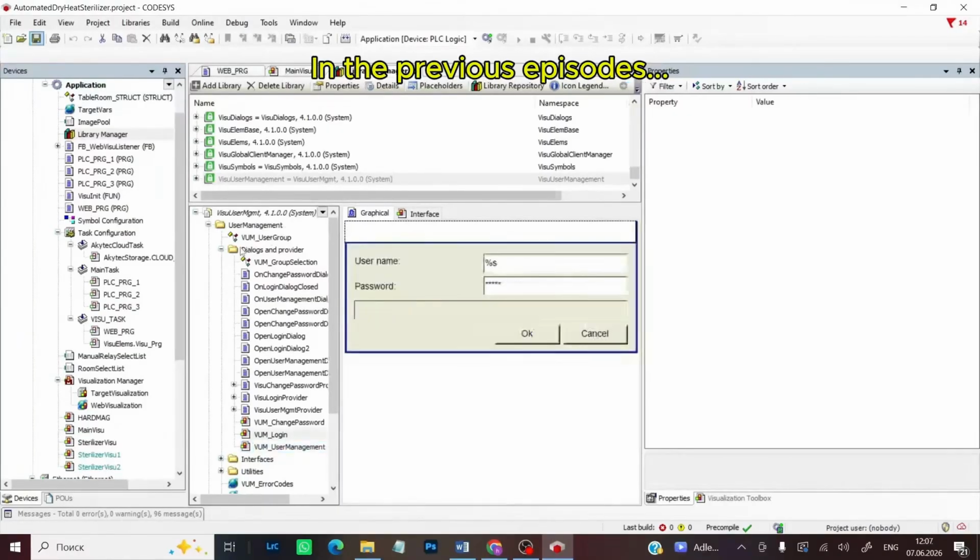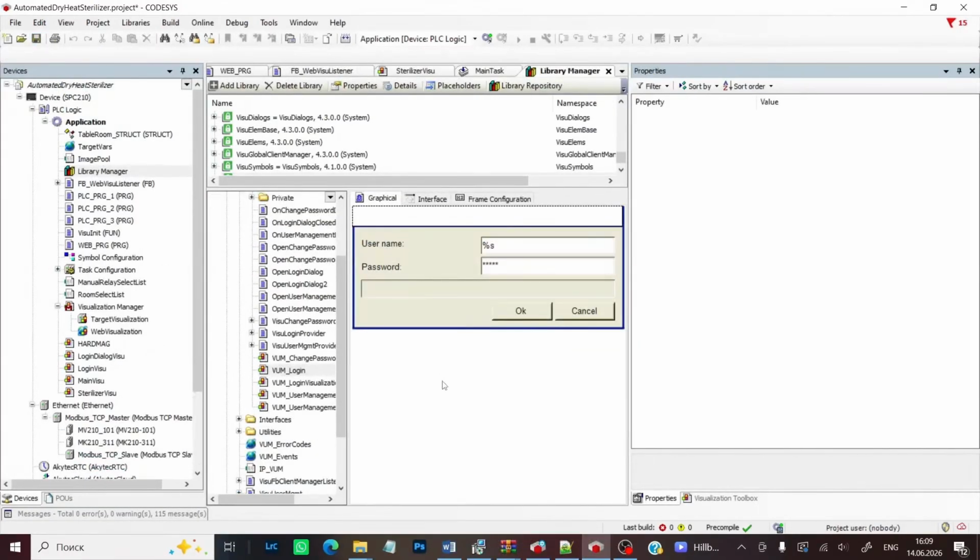But here's the problem. In this version of the library, the functionality of these dialog windows is broken. In the previous video, I mentioned that in this version of the library, the functionality of the dialog windows is broken, and it's impossible to update the library version because it's tightly bound to the IDE version. But that's not entirely true.